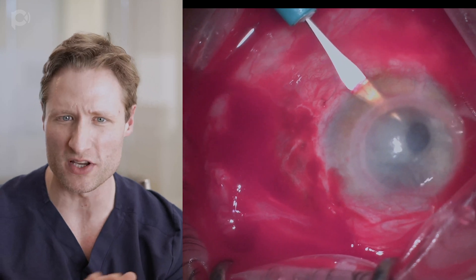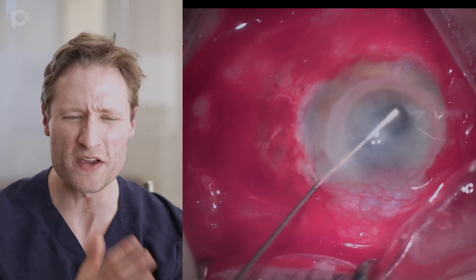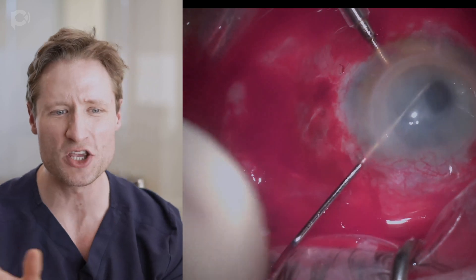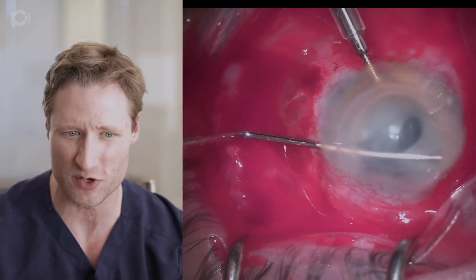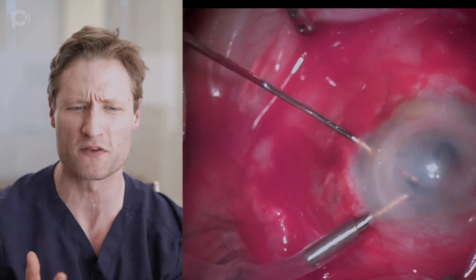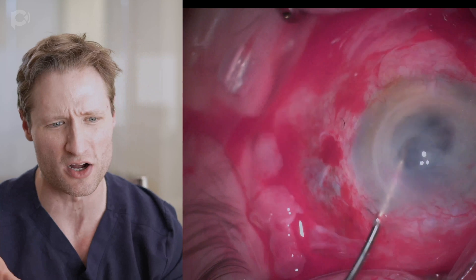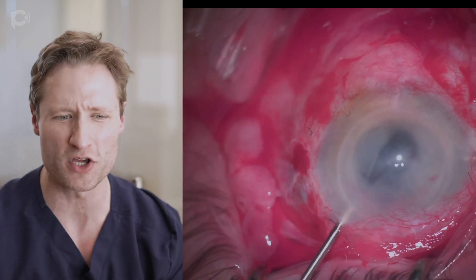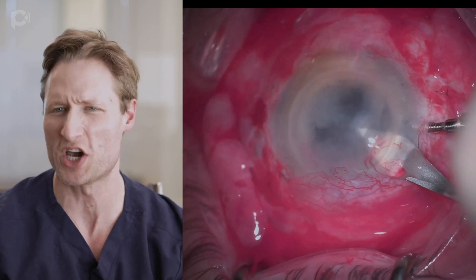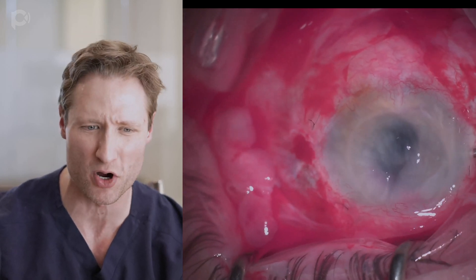We achieve a little hemostasis with local cautery. I'm trying to reform the anterior chamber. I make a few paracenteses and I'm insinuating a cyclodialysis spatula around. What's not obvious here is there's very little, if any, anterior chamber. There's just this membrane encasing everything in the middle part of the eye, wrapped up against the cornea, and it is tenaciously strong. So I'm trying to strip it free with coaxial forceps and dissect it off, and eventually I have to get intraocular scissors to cut through this retro-corneal membrane.